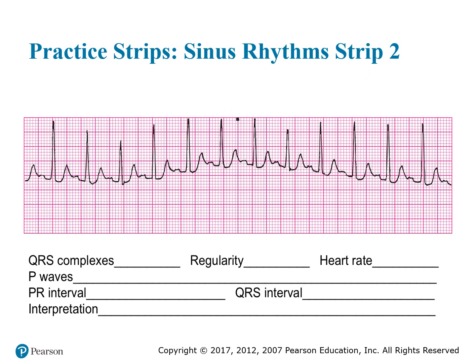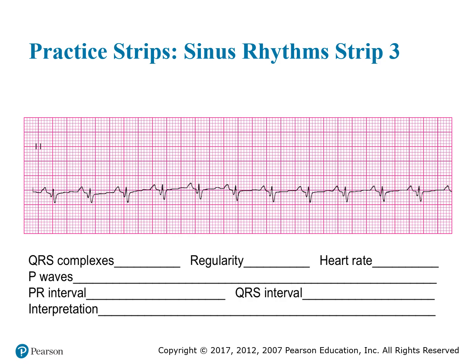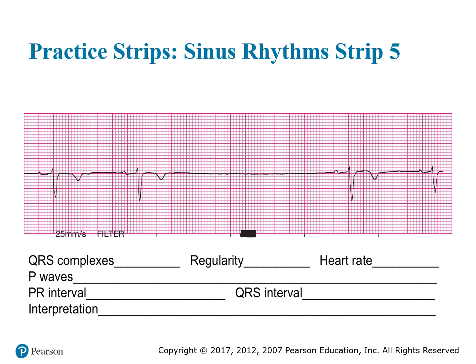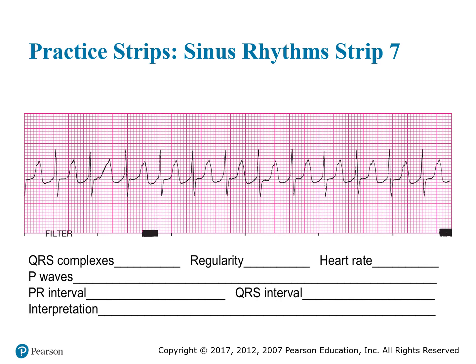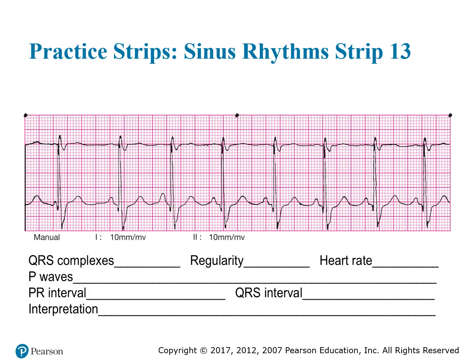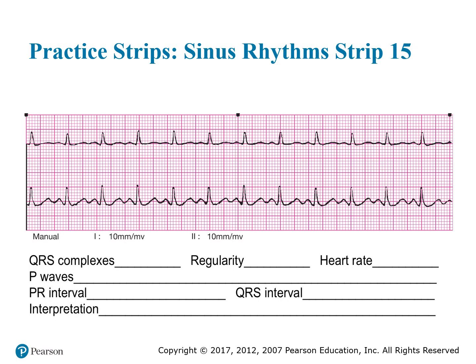Like this one, what happened here? See, it has a little bit of curvature up. Tell me what's going on there. If you look at this one, this looks kind of straightforward. That one, this one, right? Tell me what this here is, and that will be in your interpretation. This guy, this guy, this guy, this guy. So you're just going to go through the rhythms, look through them, identify them, fill out this little section, right? Give me your interpretation, and that will be your homework assignment for next week.